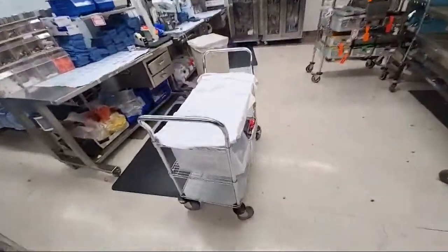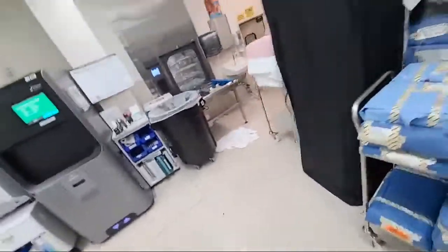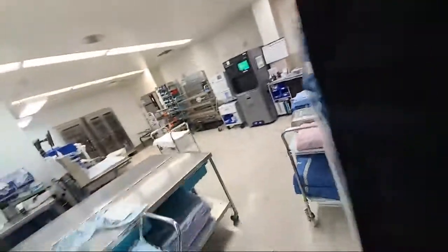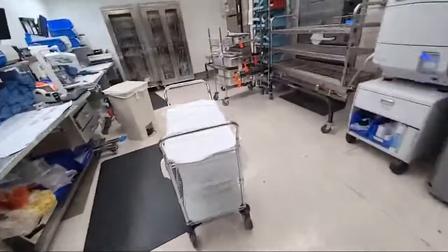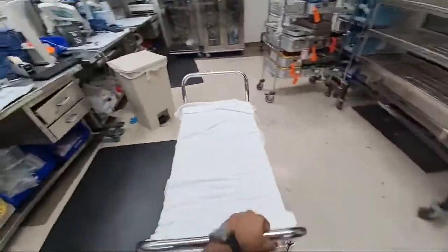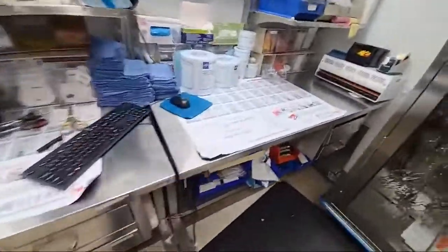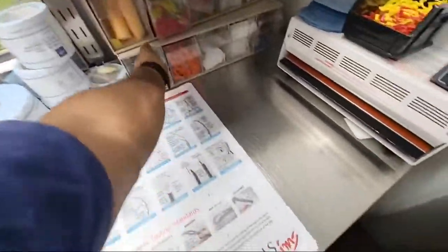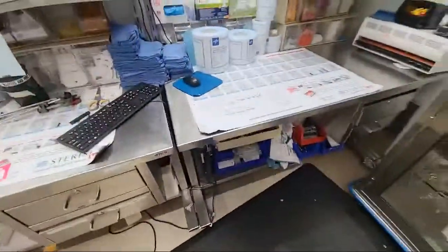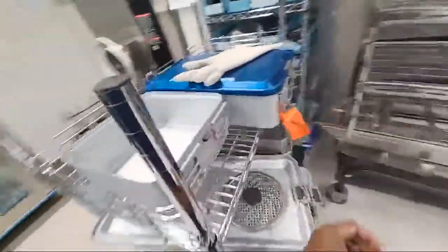Coming over from there, we load it up on this cart. Everything on there. We load everything up on here, and we take it over to our assembly area. So this is our assembly area. We wipe it down, obviously. We clean it all off, and we prepare the area. I don't have a tray to show you, but here's a rigid container.